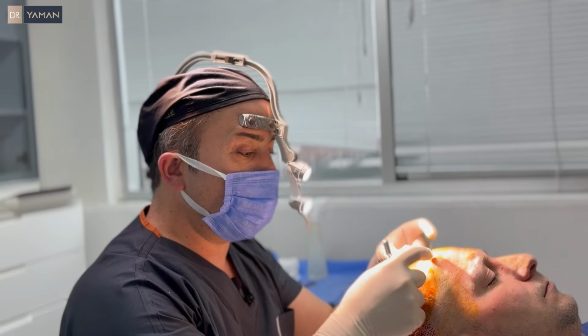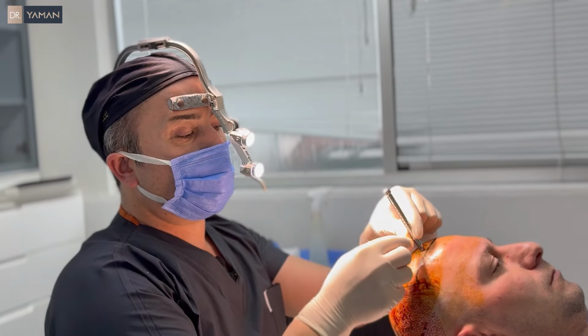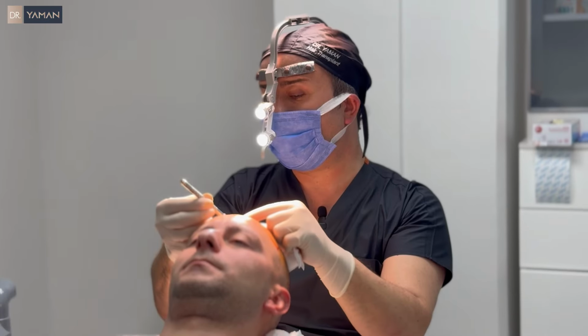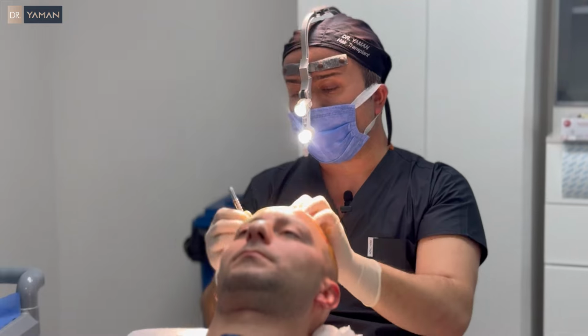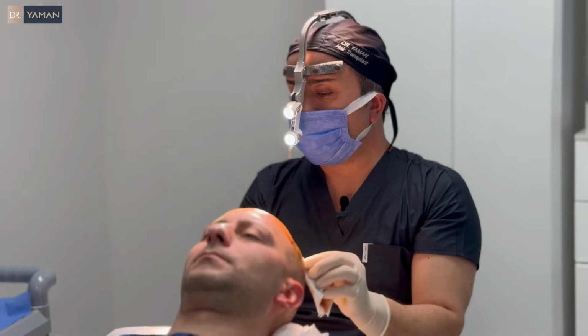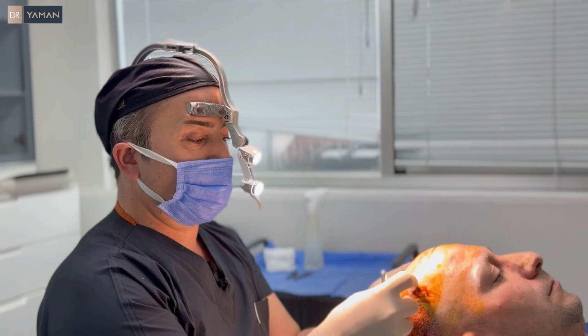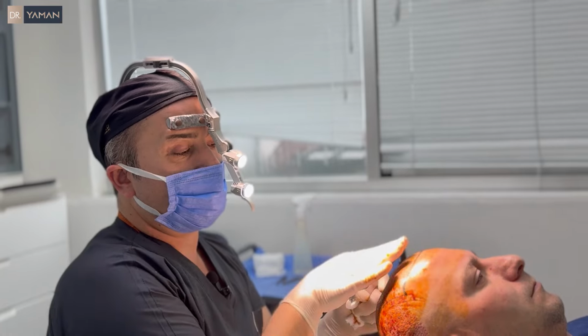This part is really important. If you put the hair like this, it will grow toward the eyes, and you need to arrange a really good direction and angle. We are lucky we have a direction from our existing hair, because he has too much existing hair, and we can see the direction.